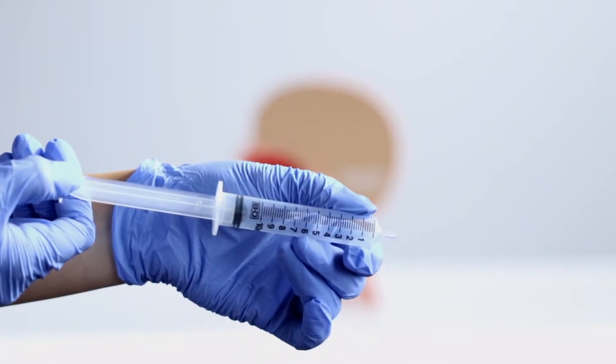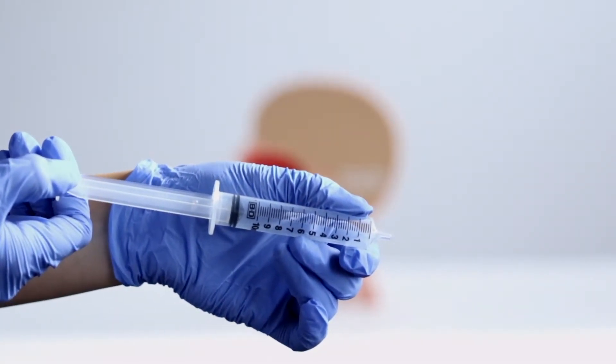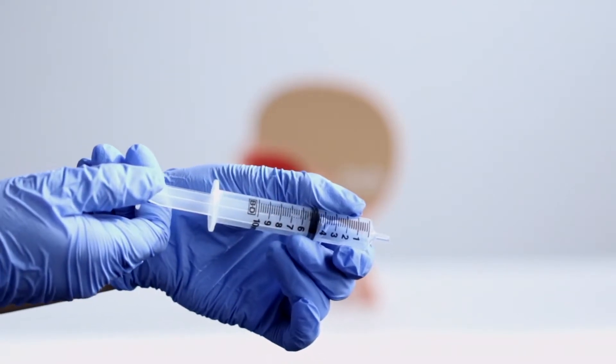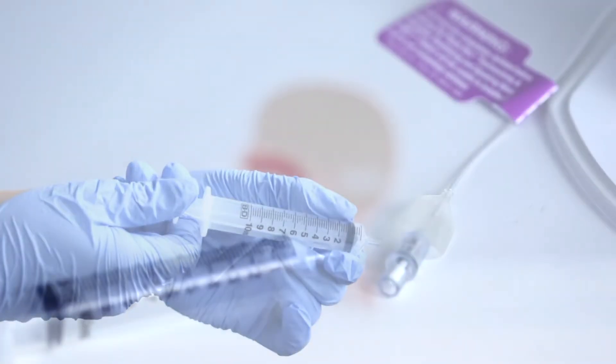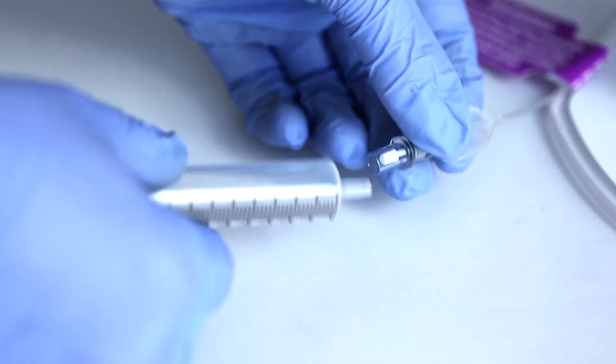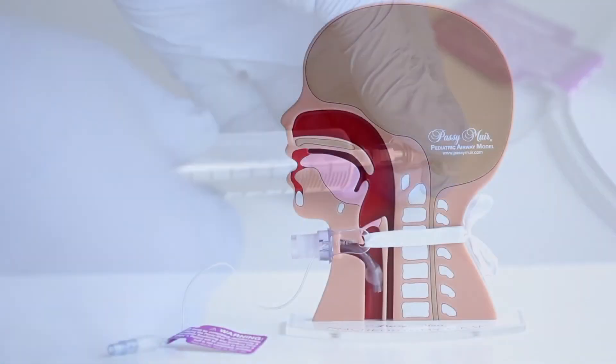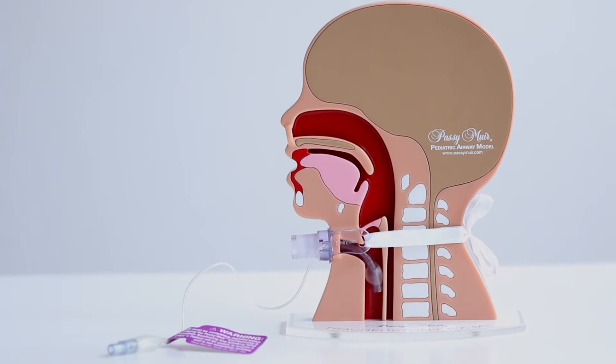To deflate the cuff, first obtain the provided syringe. Remove all air from the syringe by pushing the plunger in completely. Attach the tip or hub of the syringe into the needle valve of the pilot balloon. Then pull back slowly on the plunger of the syringe.